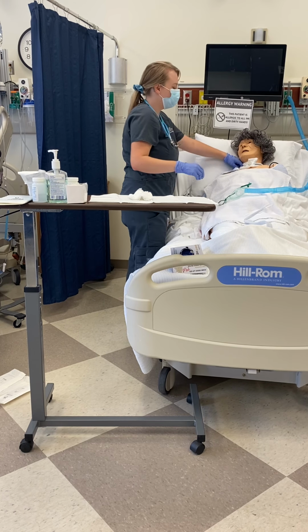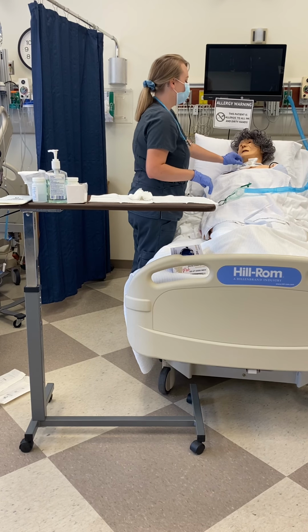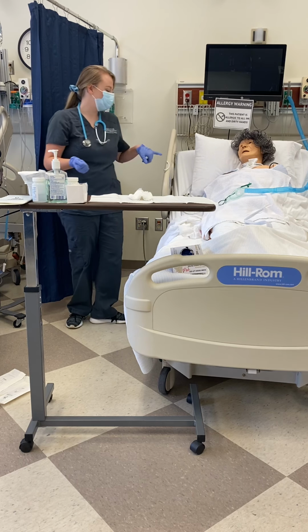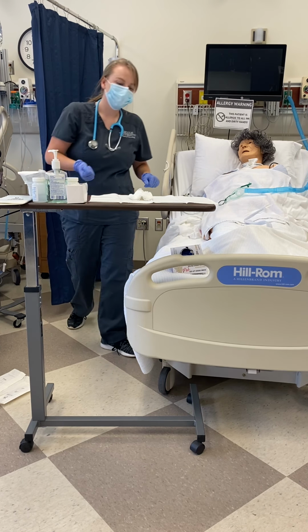And I will make sure that there's room for at least 2 fingers, but not too much room to where it can pop out. And if it were to pop out, there's always an obturator on the side of the bed or on the wall.